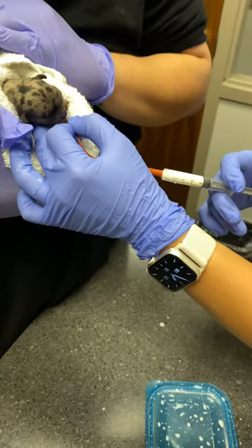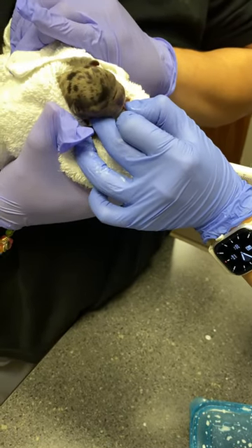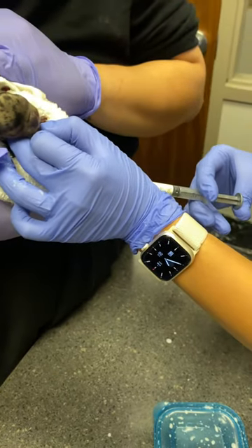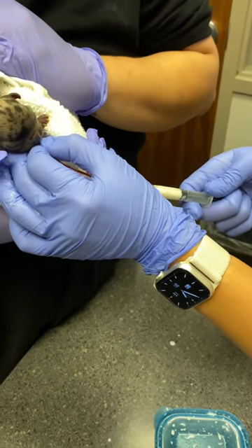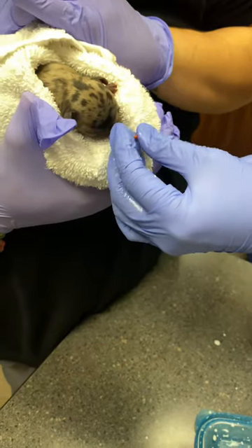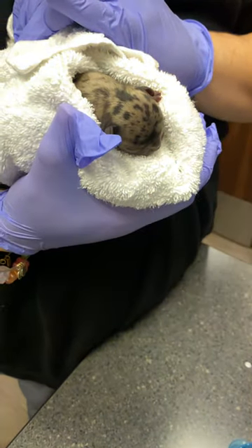Just slowly push. You're gonna have to hold this in place, and you can always check — pull if it moves — and just keep pushing. When you're done, make sure you pinch this line so when you pull it out you're not putting liquid in the lungs.